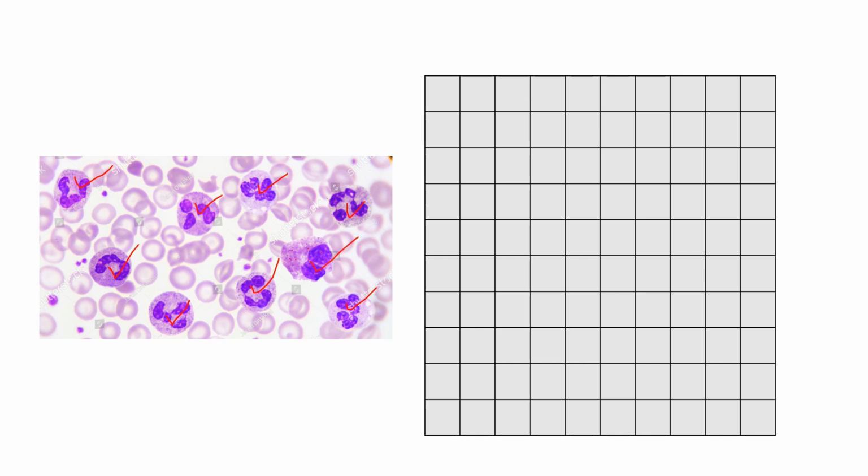So how many neutrophils do we have in this field? 1, 2, 3, 4, 5, 6, 7, 8, whereas we have one eosinophil. So when I draw this, I can just write N, N, N, N, N, and there is one E in the middle that I have written.